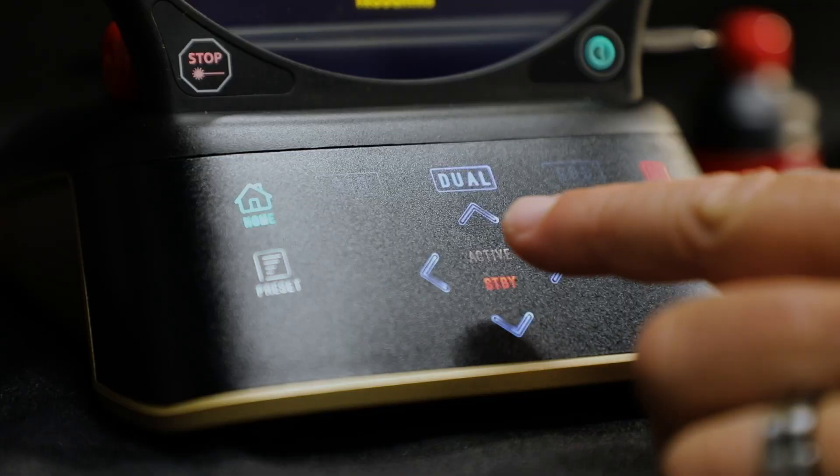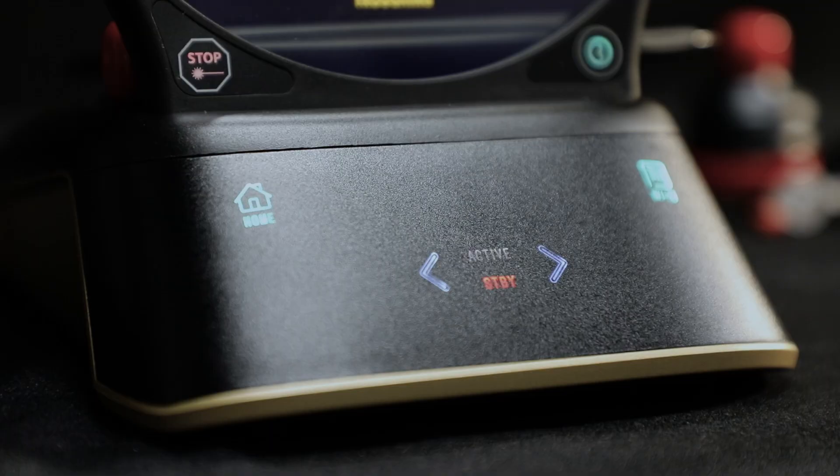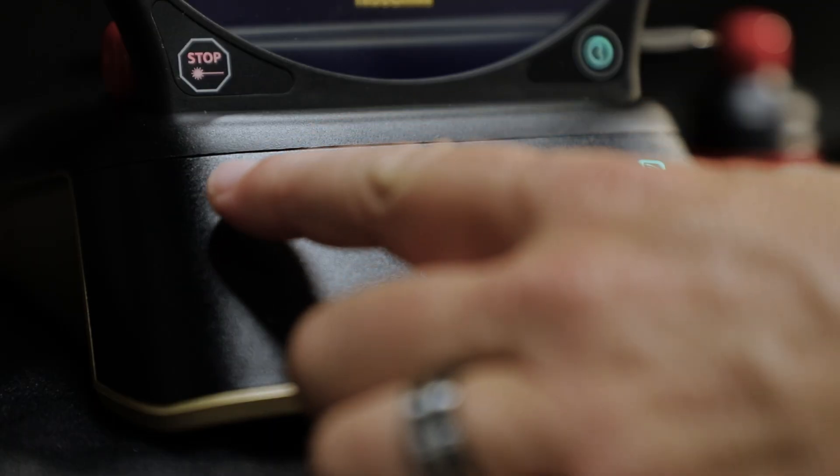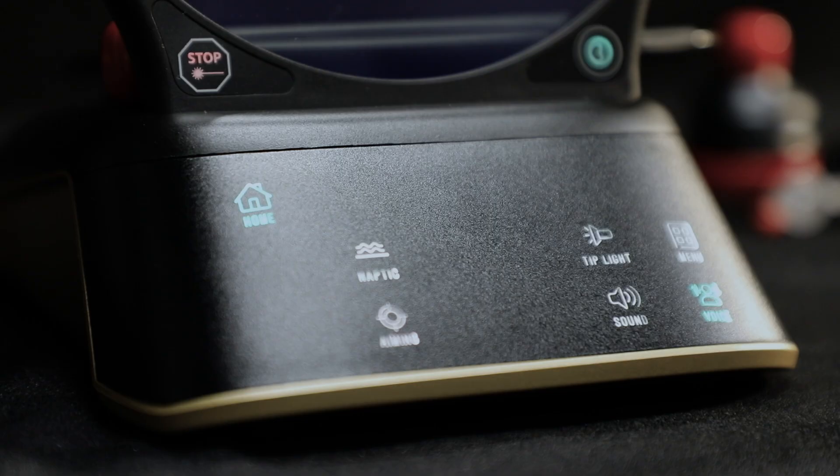The unit is designed with Guided Touch Interface, or GTI. As you operate the Gemini Evo, only relevant icons light up to help guide you through the interface and make proper input selections.